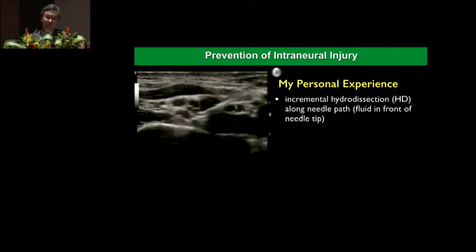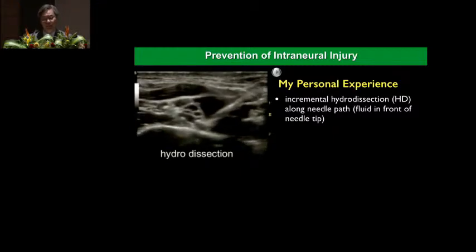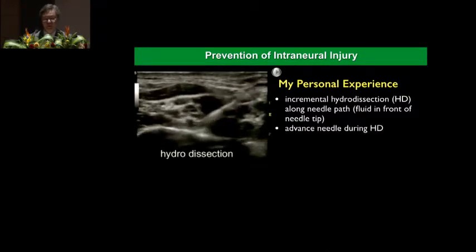So this is not evidence-based. I'm sharing with you my clinical experience. I think this helps me by avoiding nerve injury. I again do a hydrodissection method. I always like fluid to stay in front of the needle.